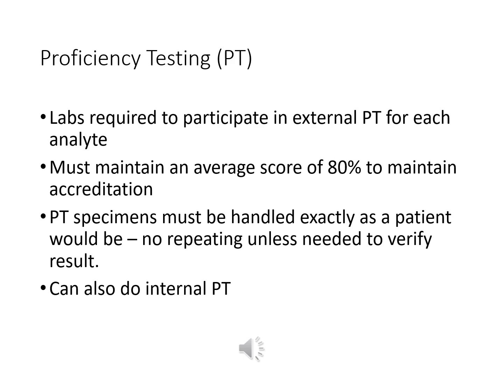So if you have 4 people in the lab that can perform a certain test, it usually comes 3 to 4 times a year. So if you happen to be that person, you'll do it once that year. They don't want the same person doing it over and over. They want to make sure and ensure that everybody in the lab who performs it can actually perform it, and they prove so by doing proficiency testing.